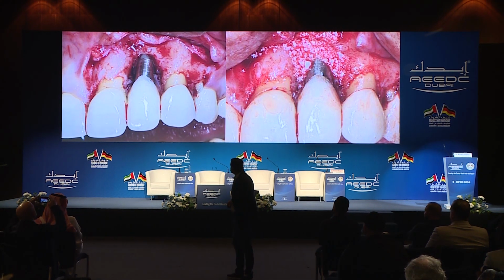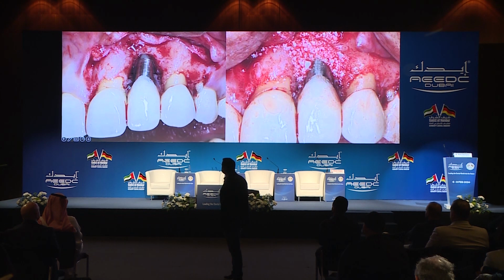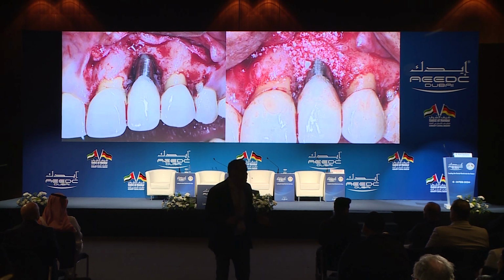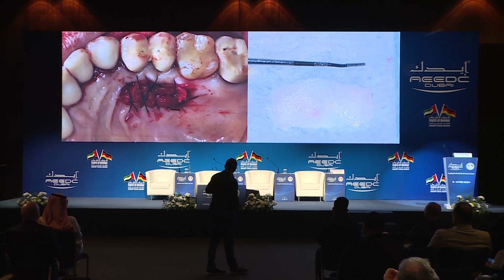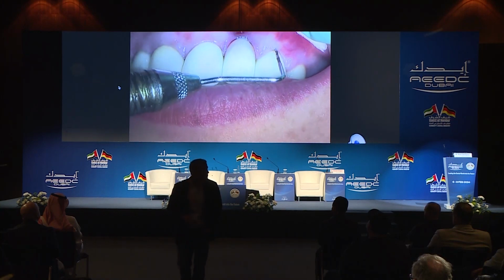So this is what we did. We first removed the crown, removed all the pink porcelain, the over contour, and look how deep this implant has been placed. We place bone? Yes, we place bone. Is this going to turn into bone? I don't think so. But why do we do it? Well, I feel good to place bone just so I can sleep better at night, but this is probably going to support my soft tissue. And then of course, we take the soft tissue because this case did not have any attached mucosa. So I took an anterior palate graft, split it into a mesial and a distal papilla. So we can try to do today a customized connective tissue graft, not one connective tissue graft that works on all of your patients. And we did the double papilla flap incision.